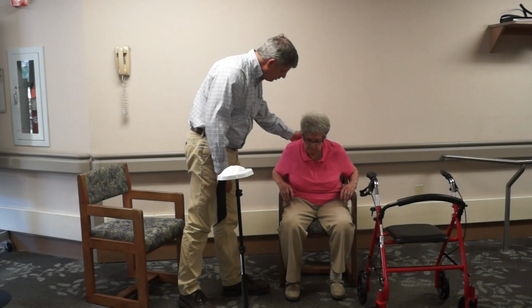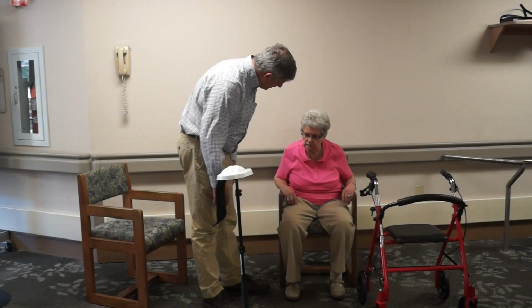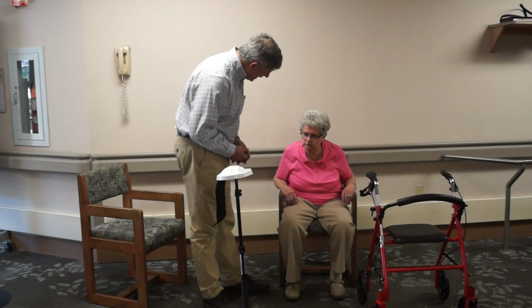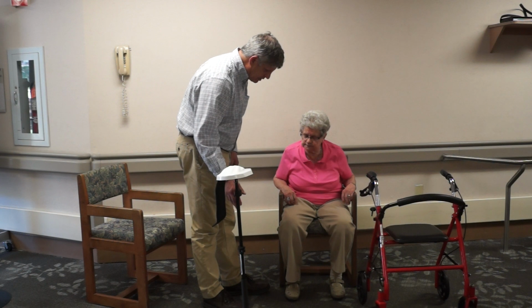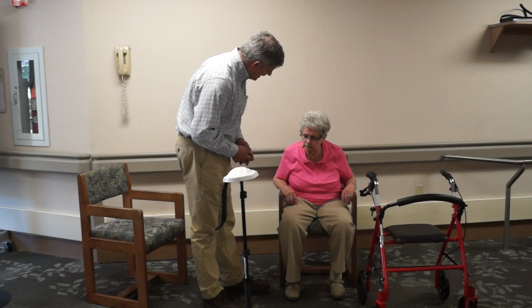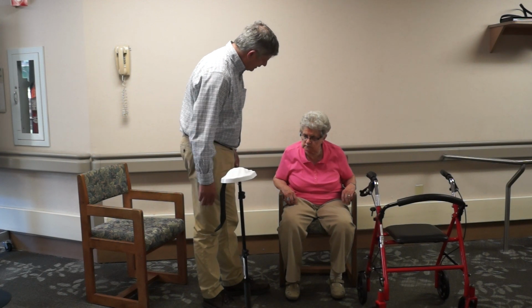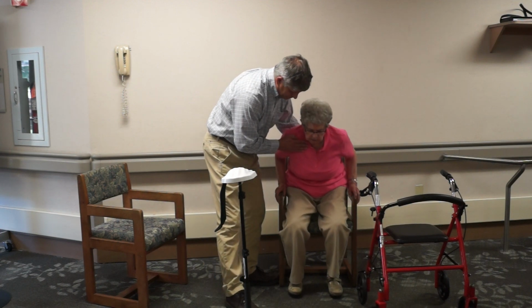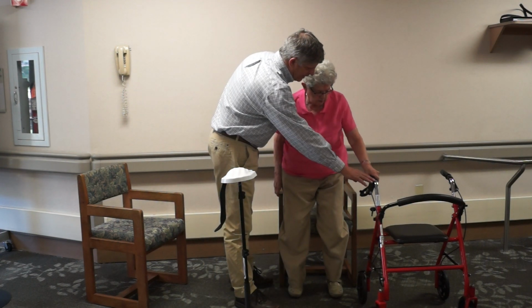Okay, Audrey, so we're going to now pick up where we left off, but we're going to now exercise while you're standing, okay? Because you've done so well, now we want to make it supportive when you're standing and able to reach to help you with greater function and your safety, your balance, okay? So I'm going to help you stand up, okay? And you can hold on with that left arm.